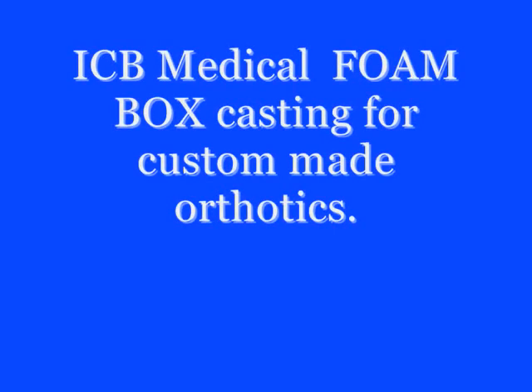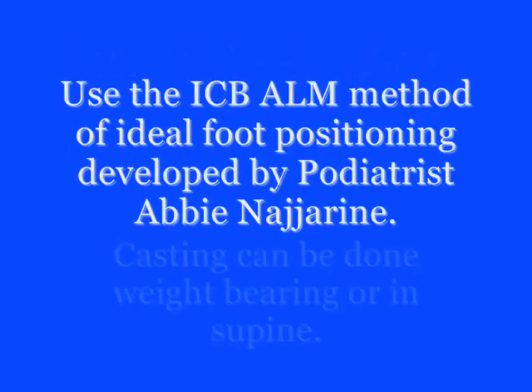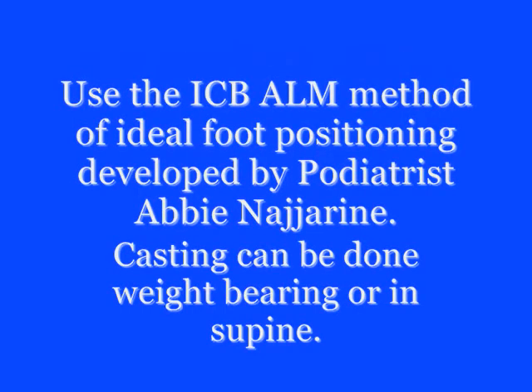ICB medical foam box casting for custom made orthotics. We're positioning the foot using the ICB ALM method.